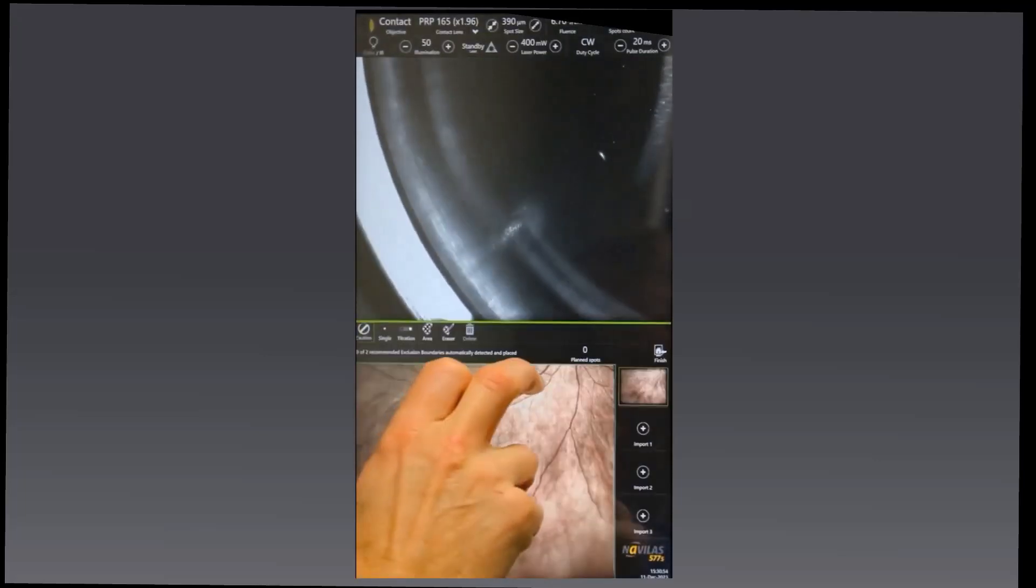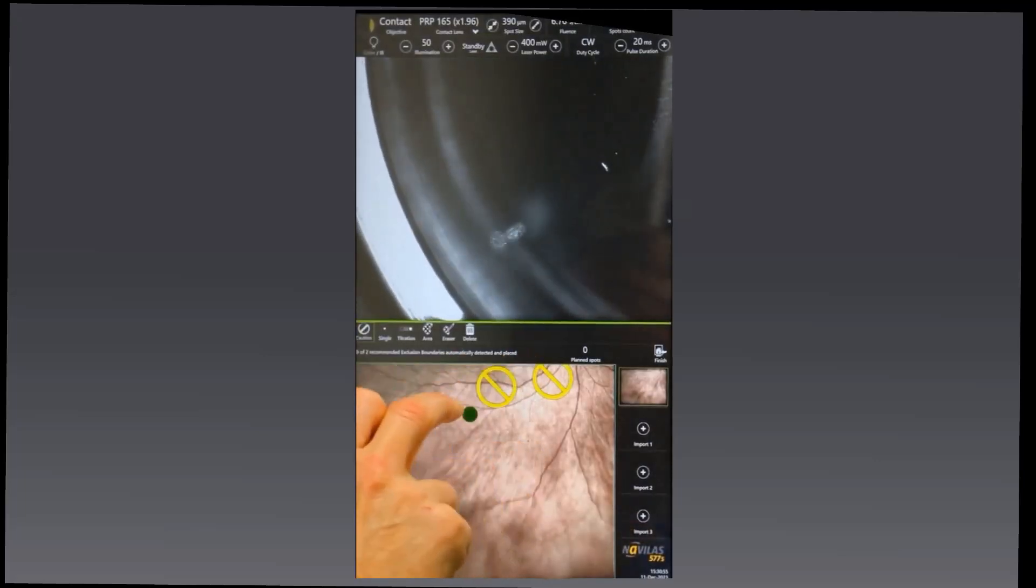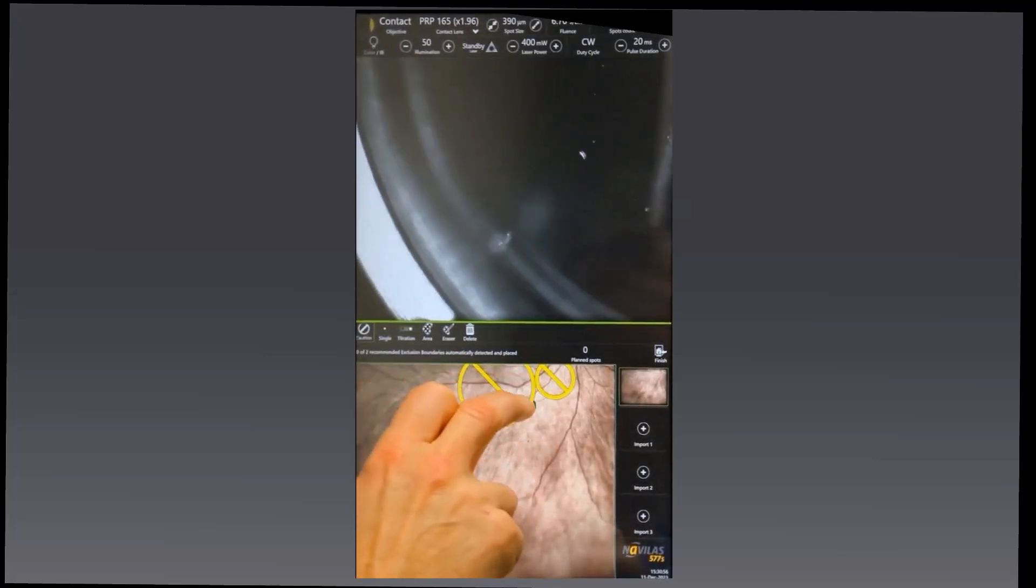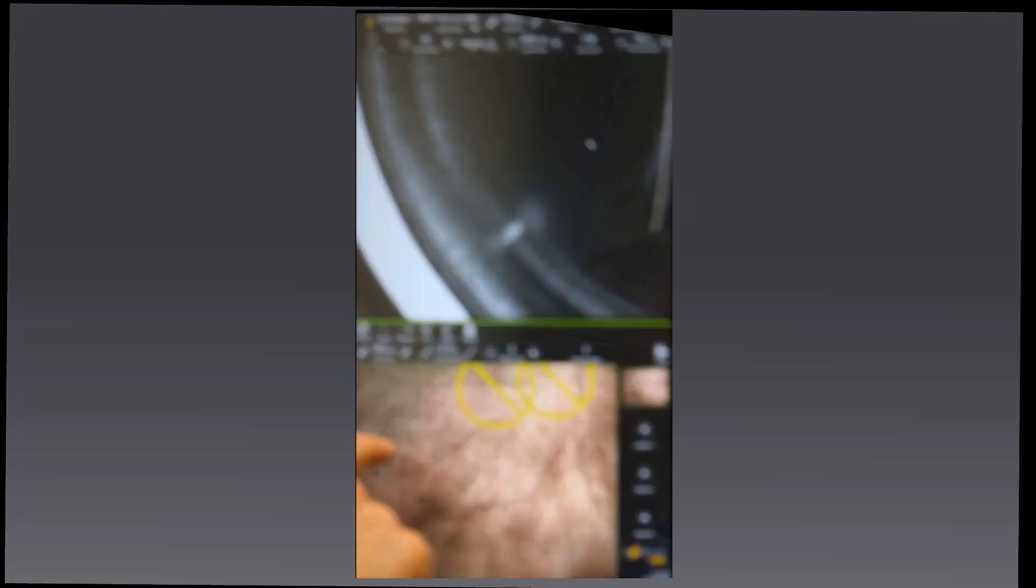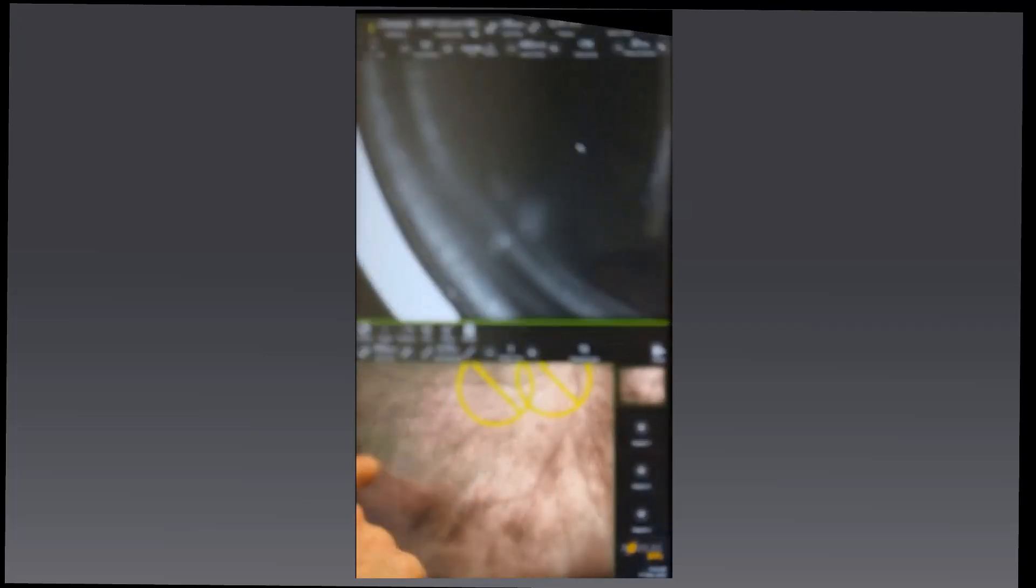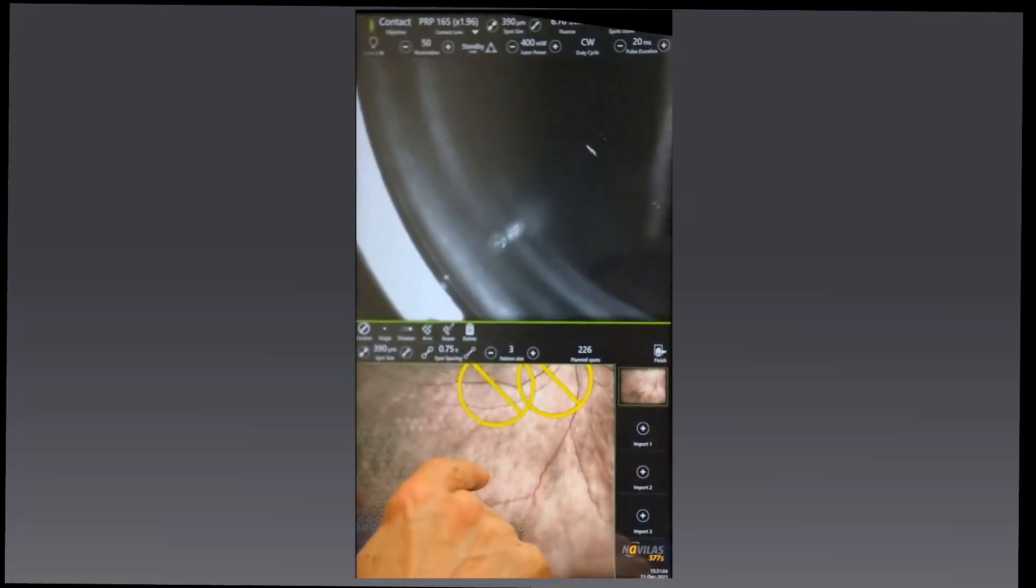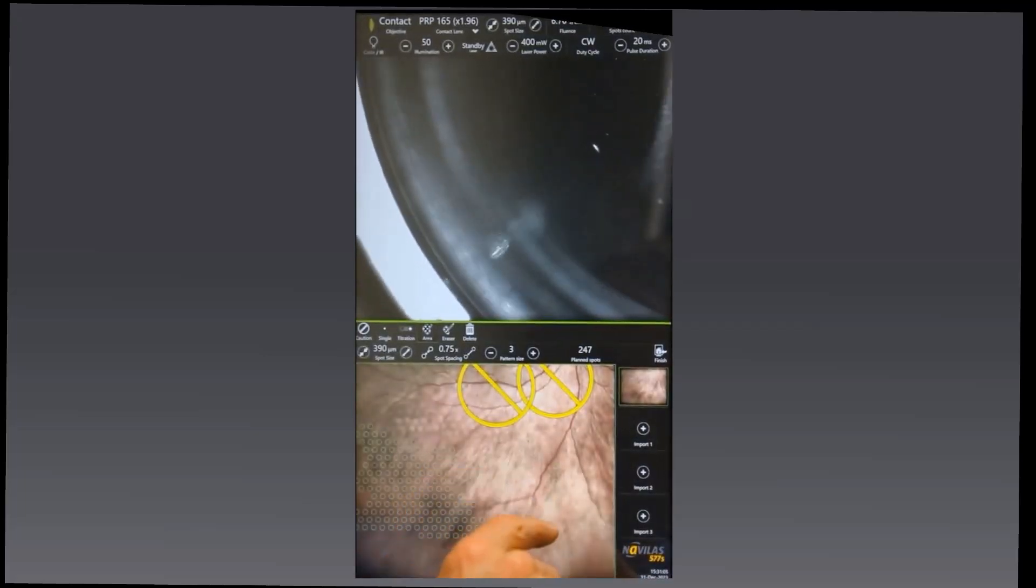Here I'm mapping out quite a large area. I know he's tolerating it quite well, so I'm emboldened to try and map a large area and see how well he copes with that.